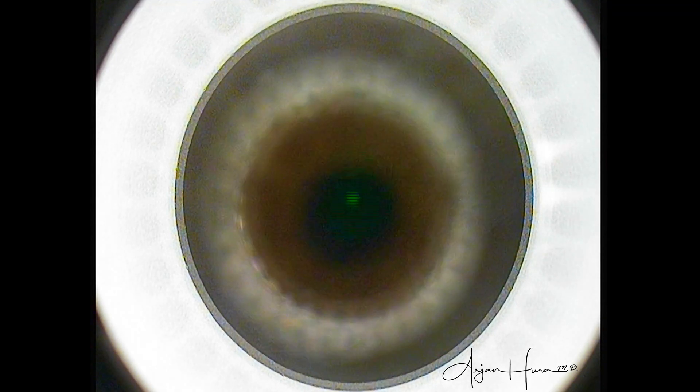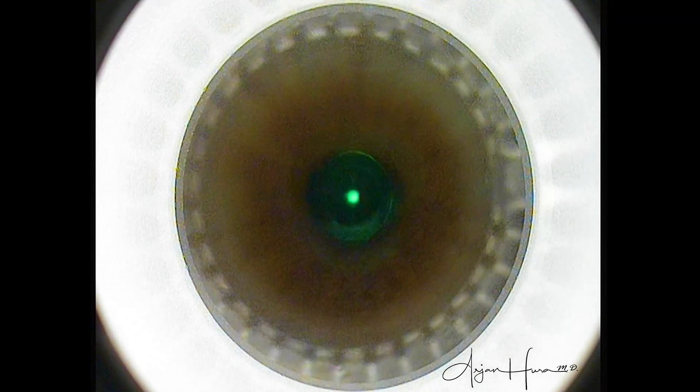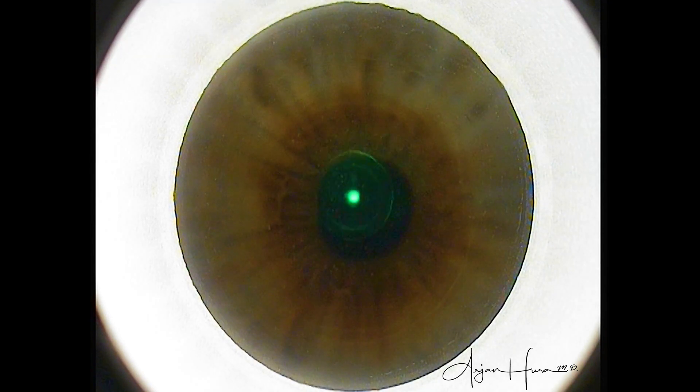In myopic patients, this tends to be inferior, nasal, or infranasal — not always, but most of the time. If we center the treatment on the pupillary axis, we risk a de-centered correction of the refractive error, higher order aberrations, and unwanted visual side effects.